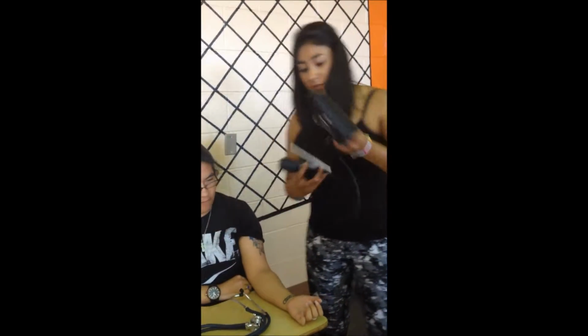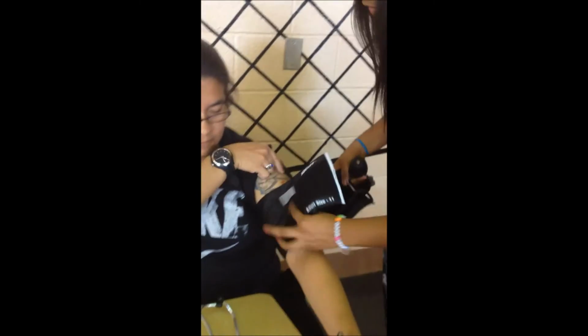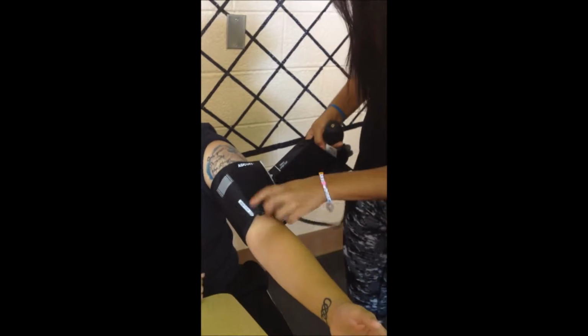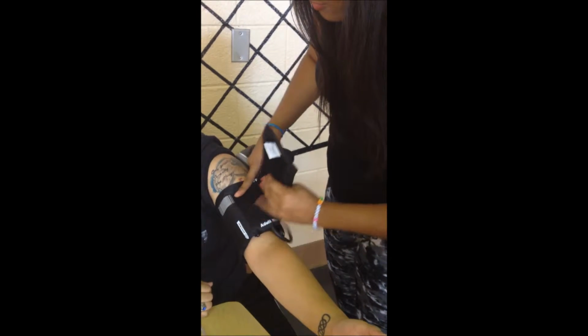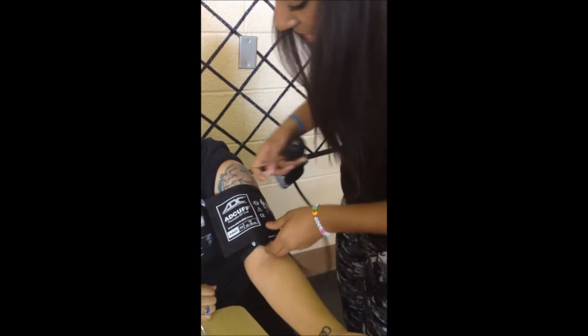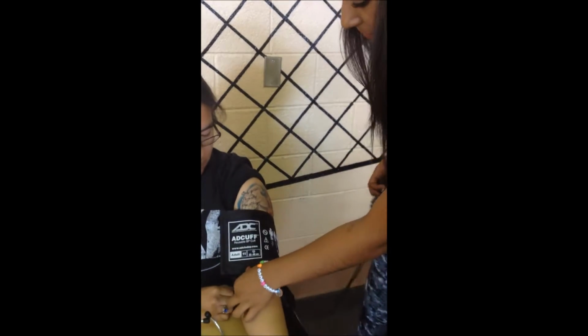Then grab the cuff and place it on the upper arm of the patient. Make sure it is snug, not very loose or very tight. And make sure you align this mark to the brachial artery.